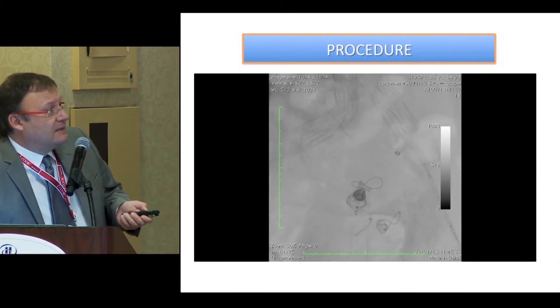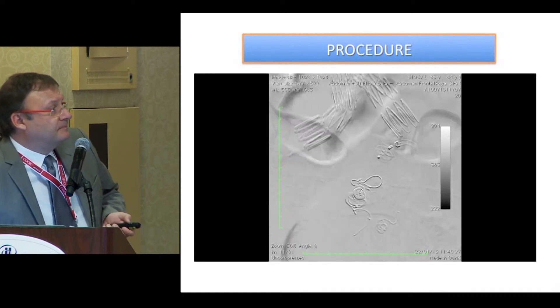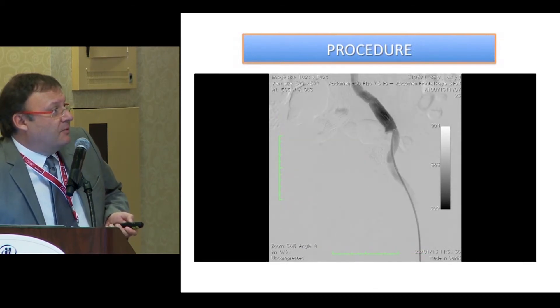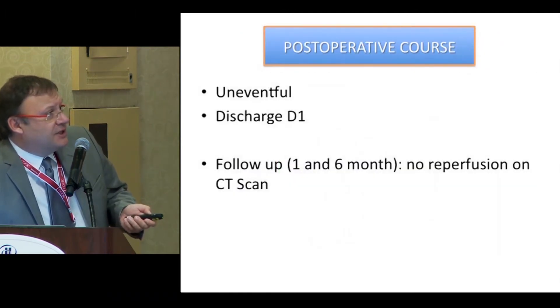You can see that we were very stable in the aneurysm. We had no more distal perfusion, we had some clots, and we placed the sheath at the ostium of the iliac.